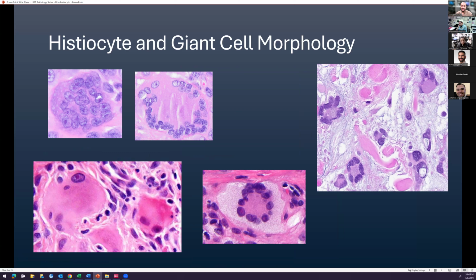Like I said, multinucleated giant cells are a pretty prominent component of these tumors, but also of a lot of other lesions, whether tumors or reactive things. These are only some of the various types of giant cells that you might see in general practice. Do you know what some of these are? They all have names, obviously. What might this one be called?